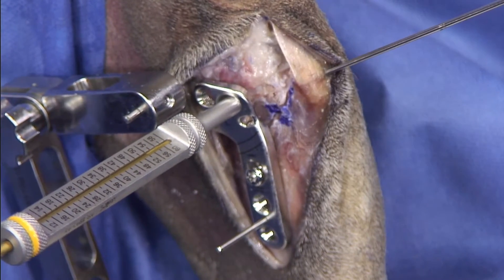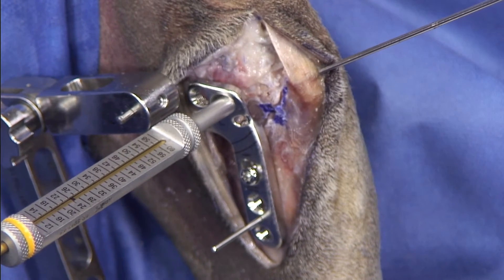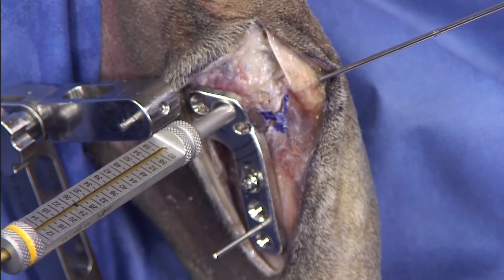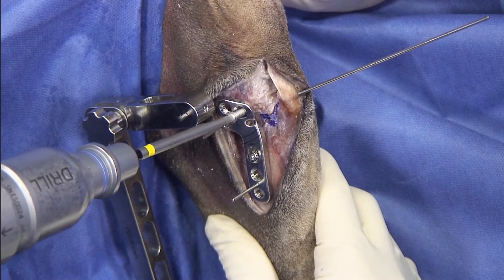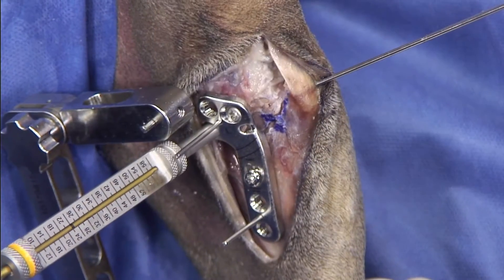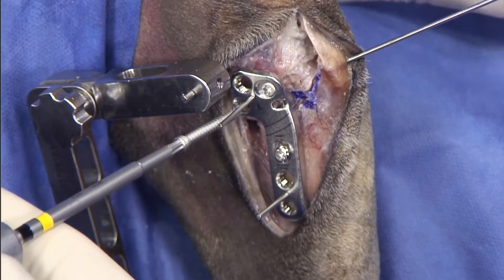I generally start from the cranial hole and maybe go to the most caudal one. Right now I'm measuring about 24, 25, so based on the measurement I would get a 28. Measuring again, 24 — so we'll get another 28.